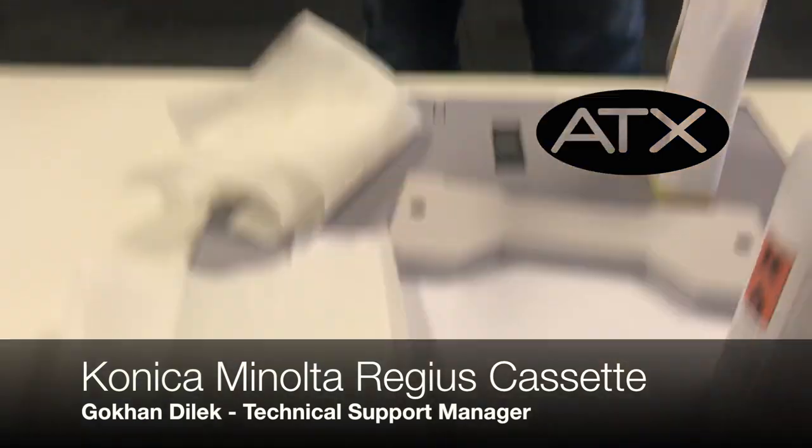Hello everybody. Today we're going to be cleaning a Konica Minolta Regis Sigma 2 cassette.